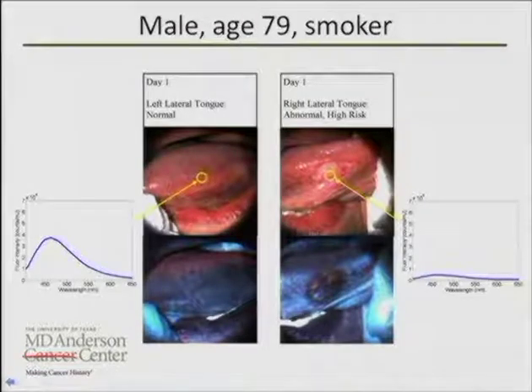Now, I've talked about evaluating the diagnostic performance of these different types of devices, but I don't personally really see these devices as diagnostic tests. The way I see them is that they are tools, very useful tools that can be used by a knowledgeable clinician to help see things that are otherwise not evident. And so there are several different clinical situations where tools like this can be useful. So one is, as I've already described, pre-surgery, during surgery, and post-surgery.